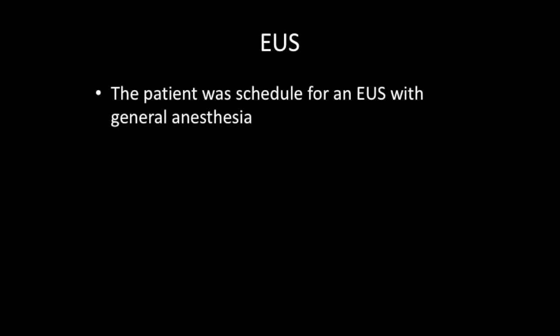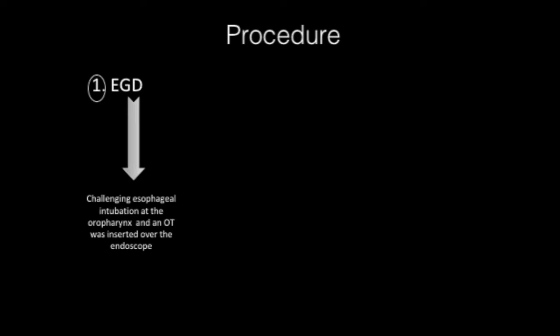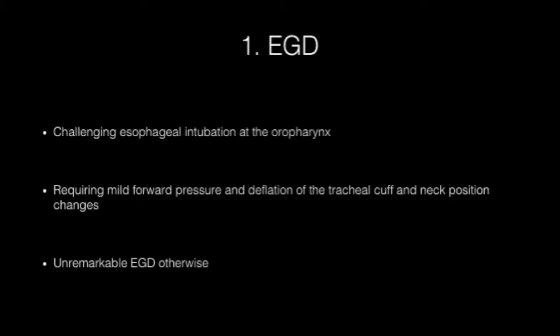The patient was scheduled for an EUS with general anesthesia. In our department, the general diagnostic algorithm used for EUS always starts with a complete evaluation under EGD. This revealed a challenging esophageal intubation at the oropharynx, requiring mild forward pressure, deflation of the tracheal cuff, and neck position changes in order to pass the adult endoscope. Passage of the EUS into the stomach proved impossible.